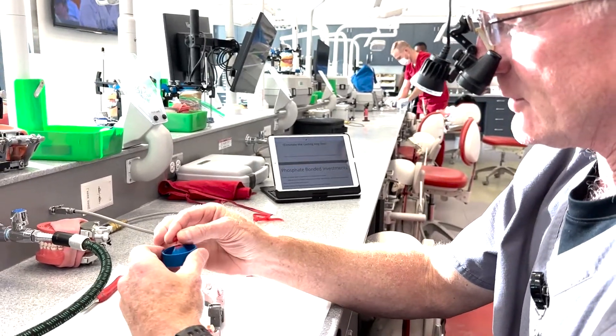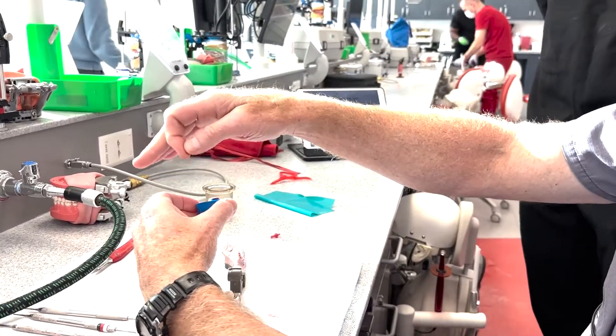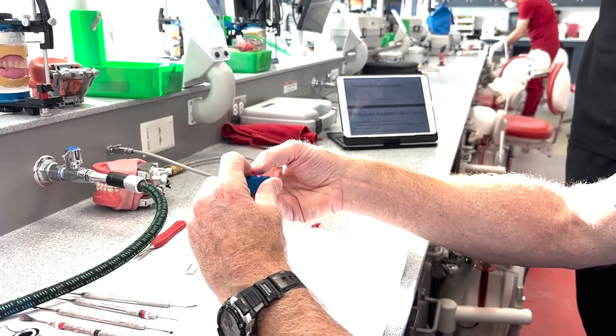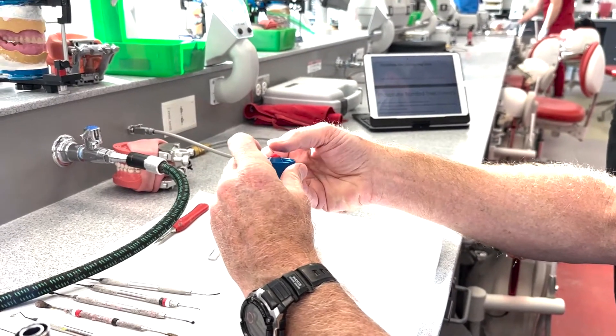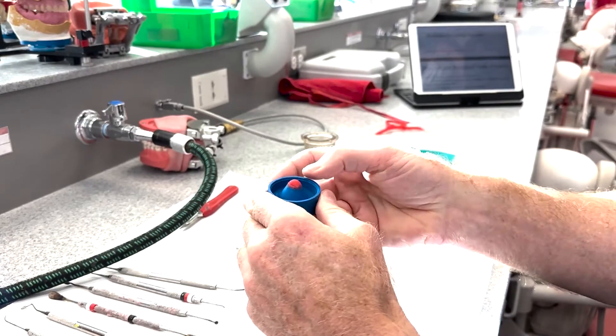Alright, so one thing I'm going to do is make this a little more convex, so it's a little more flowing. I'll add just a little bit of our rope wax there, just kind of turn that into a little bit of a dome.